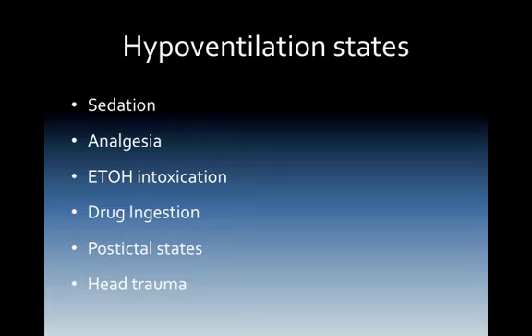ETOH, or alcohol intoxication, low ventilatory states would increase the amount of end-tidal CO2. In these, if they are hypoventilating, we will increase the amount of CO2. Drug ingestion with respiratory depression also increases the amounts of end-tidal CO2. Postictal states: is the ventilation improving the postictal state or not? Increasing amounts of end-tidal CO2.